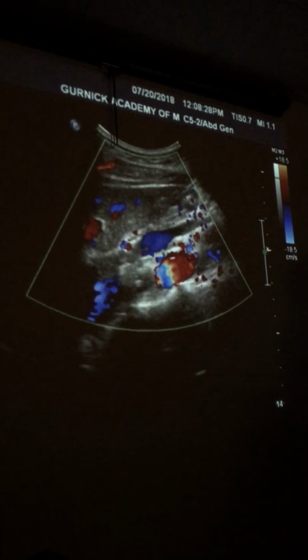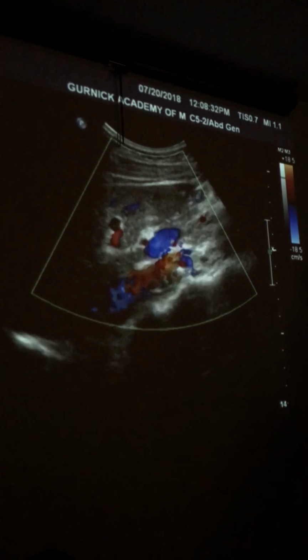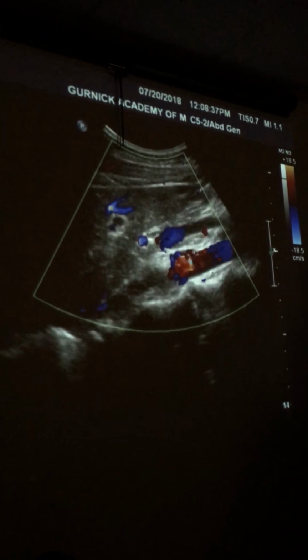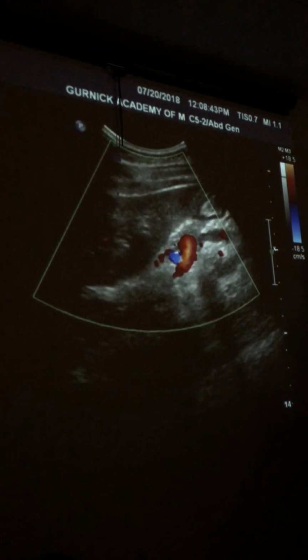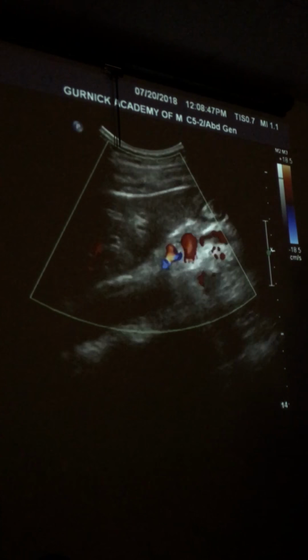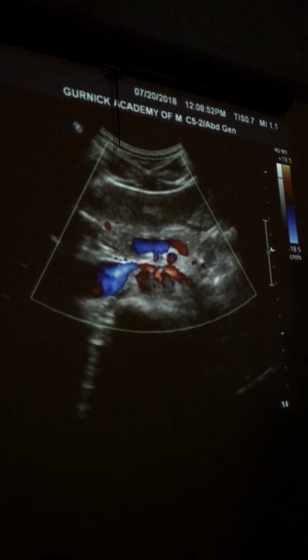If I need to find it, I go long on it. I get my long portal vein, and I'm long to her body, and I'm just going to sweep towards the liver. If I get all the way into the liver, then I'm just going to sweep back. Usually it's going to be around the level of my celiac SMA. So you can find the SMA and just toggle over, and you should see the SMV also, right? You should.